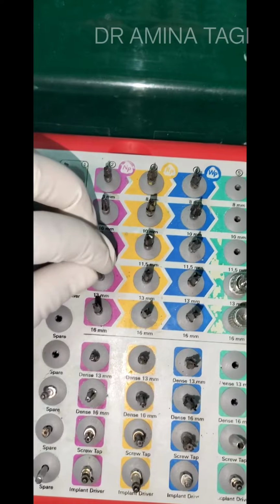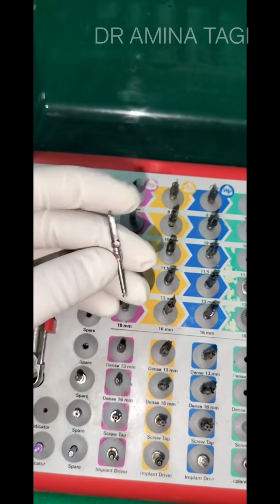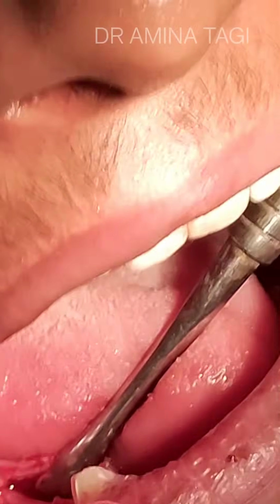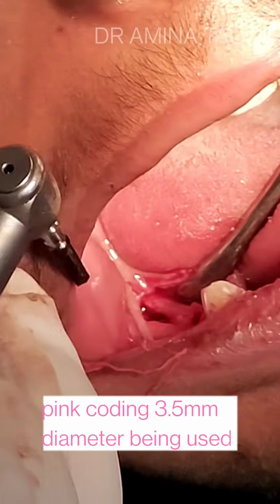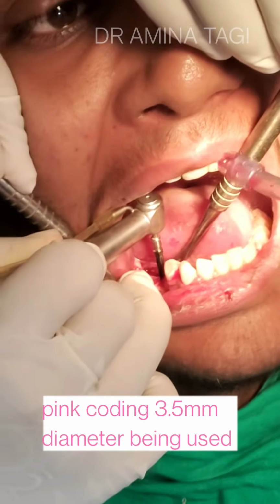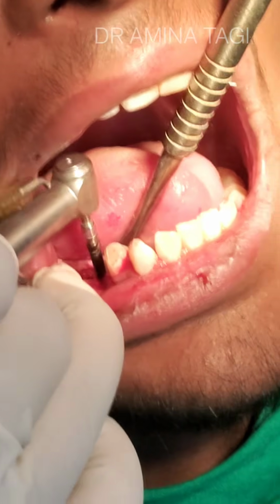So now I am taking the 3.5 mm drill, and let's start our osteotomy for the final shaping drill. This final shaping drill will just sequentially follow the pathway of the implant bed made by the pilot drill. These are just used for widening the osteotomy to the matching diameter of the implant being placed.